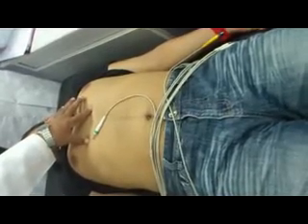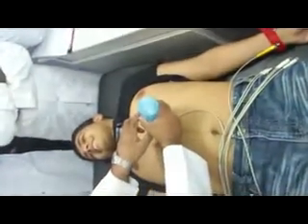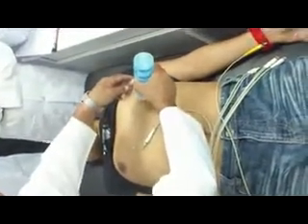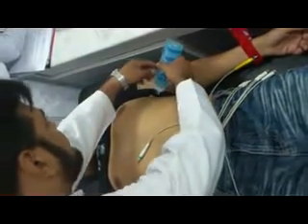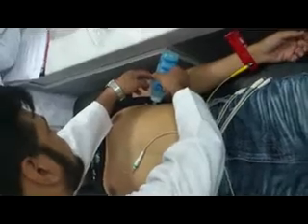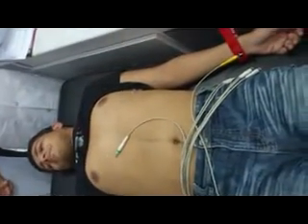Okay? Now, this is the second rib, second space, third rib, third space, fourth rib, fourth space. This is the space. So one here, one here. Okay? I will start from here. 1 and 2. So first I will put here, here. If you come one space down, here, anterior axillary and mid-axillary. Okay? And this is in between. All 6?